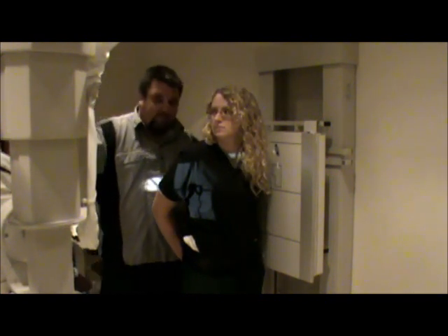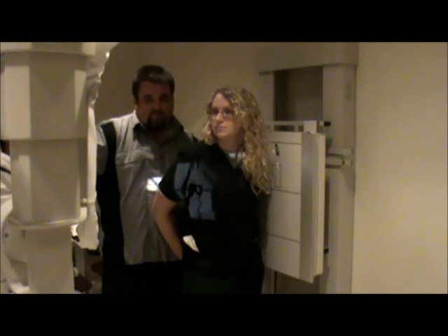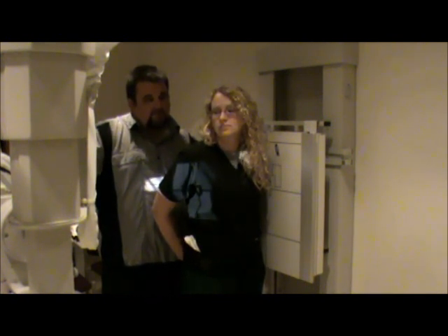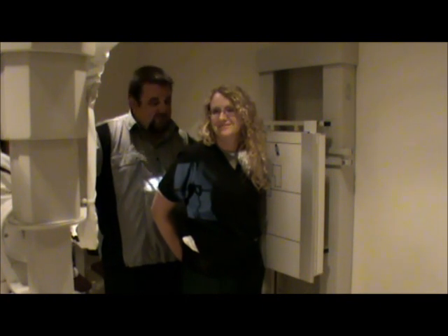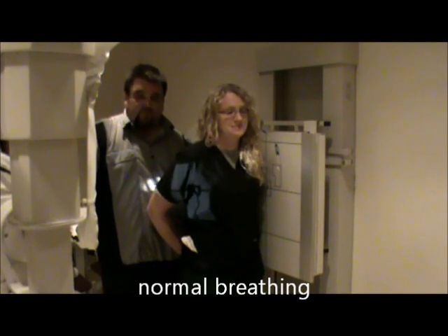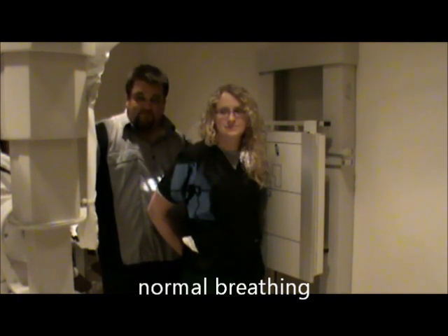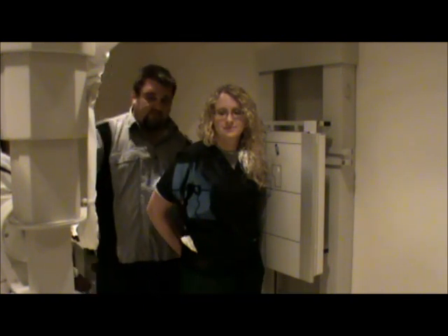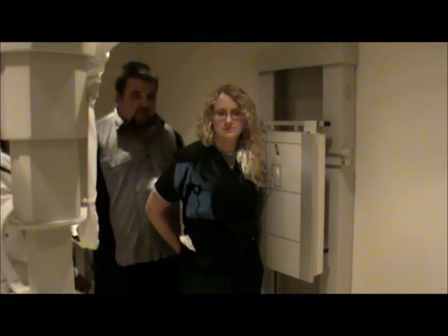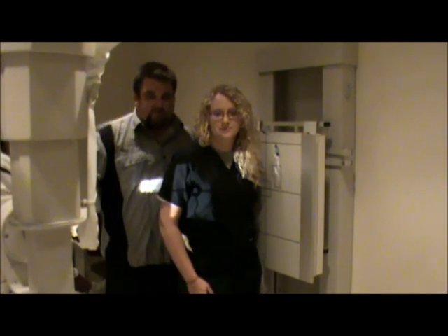The patient is going to breathe normally — we're going to do normal breathing, not a deep breath. Then we're going to make the exposure. This will be our lateral sternum. These are our sternum x-rays.